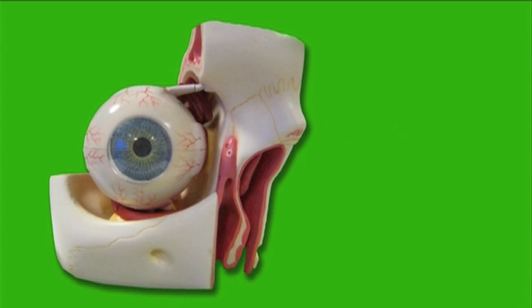Now, we will identify the vital orbital structures as they are related to the needle tip pathway during the 3 stages of the orbital block. Stage 1.